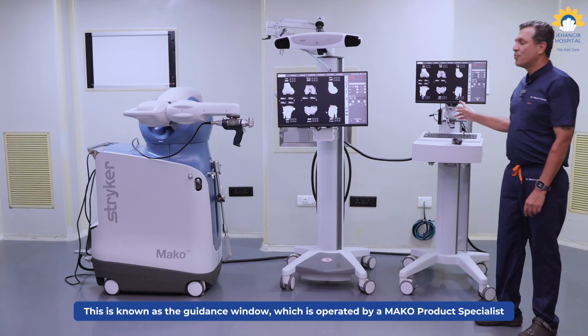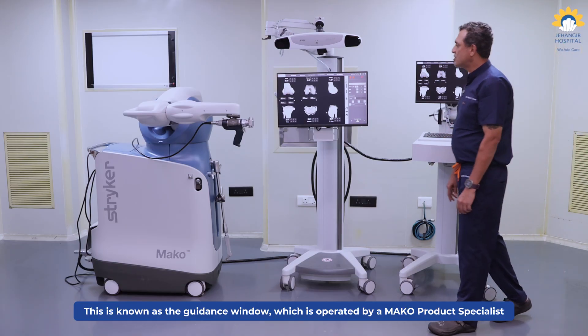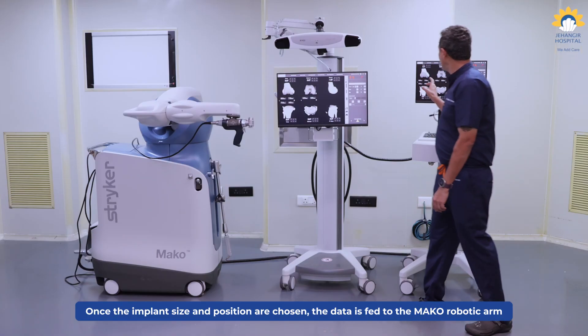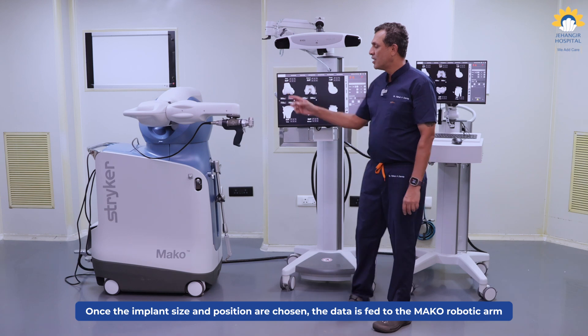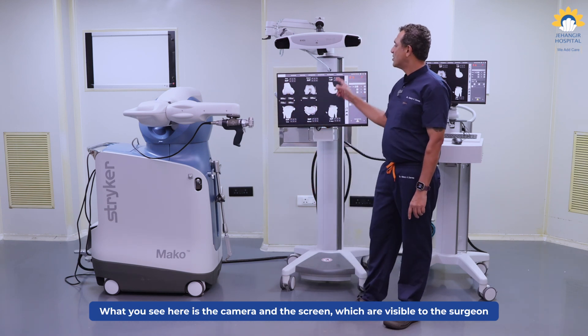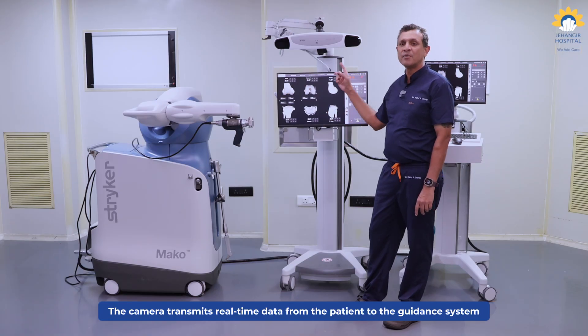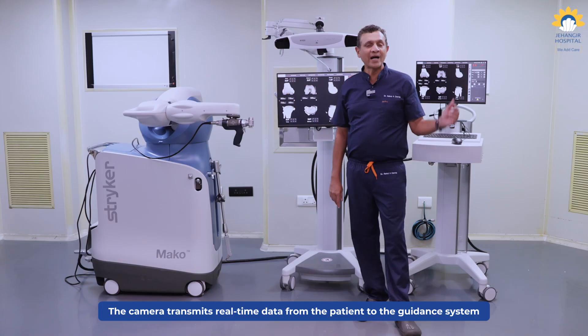This is known as the guidance window, which is operated by one of the Mako MPS or the Mako product specialist. And the data from here, once the different options in terms of the implant size and the position are chosen, they are fed to the Mako robotic arm. What you see here is the camera and this screen is visible by the surgeon. The camera helps through data transmission in real time from the patient to the guidance system.